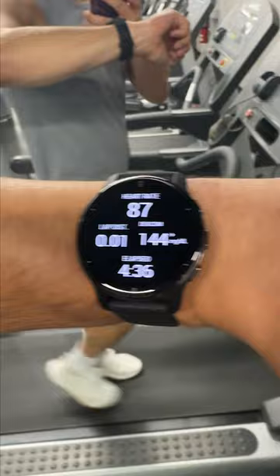I'm wearing the Venue 2 Plus, but there's a long list of other supported Garmin watches. This one gets up to nine days of battery life. Stay tuned for more diabetes tech and tips.